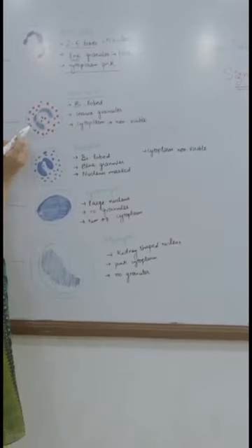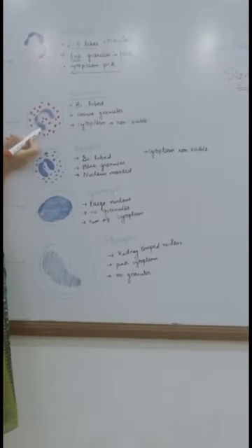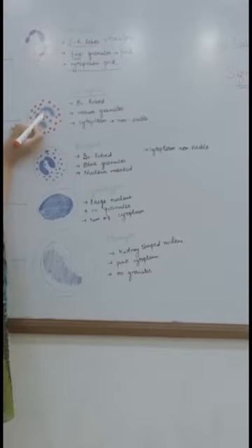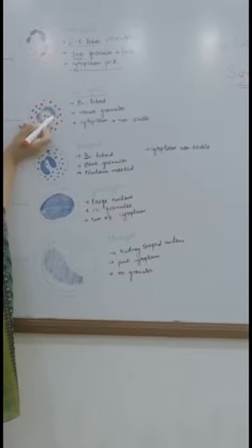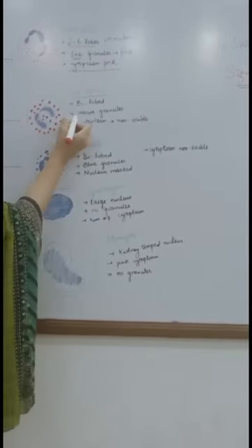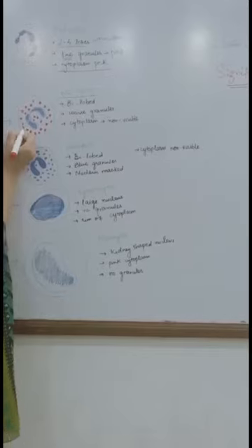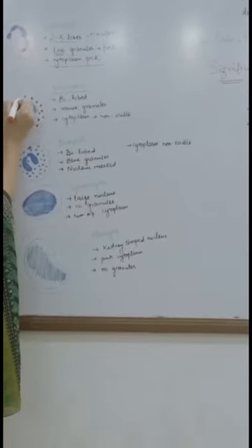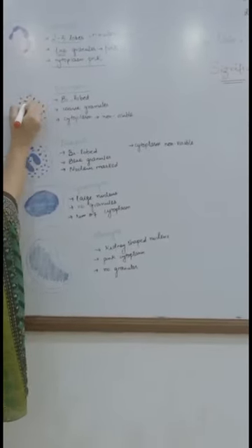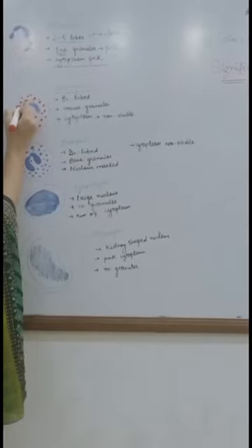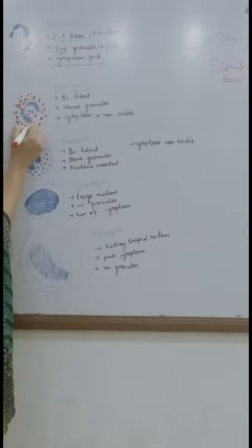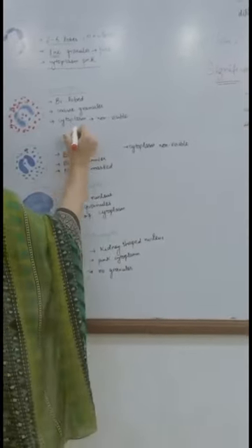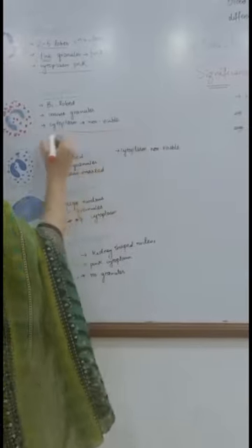Next we have eosinophils. Eosinophils have bi-lobed nuclei — this is one lobe and this is the second lobe. These have coarse granules which are also pink, but coarse, meaning rough and larger. So they mask the cytoplasm, and the cytoplasm appears almost non-visible due to the presence of these coarse granules.